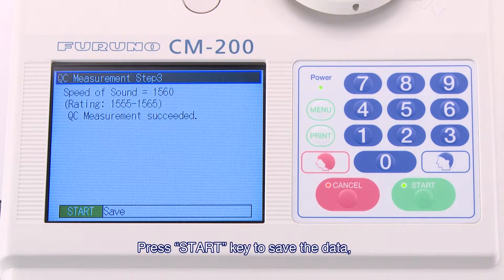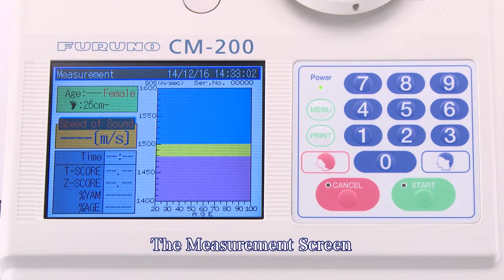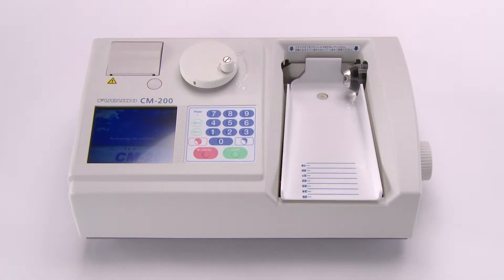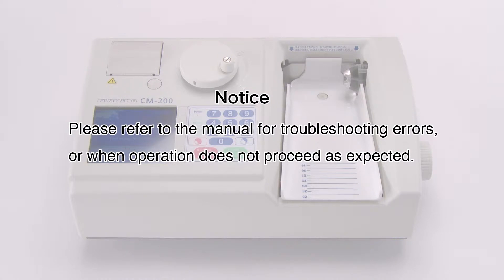Press the Start key to save the data. Then, press the Cancel key to proceed to the measurement screen. This completes the quality control measurement. Please refer to the manual for troubleshooting errors or when operation does not proceed as expected.